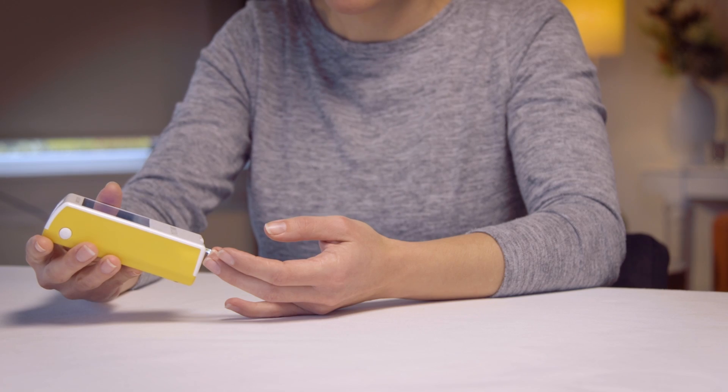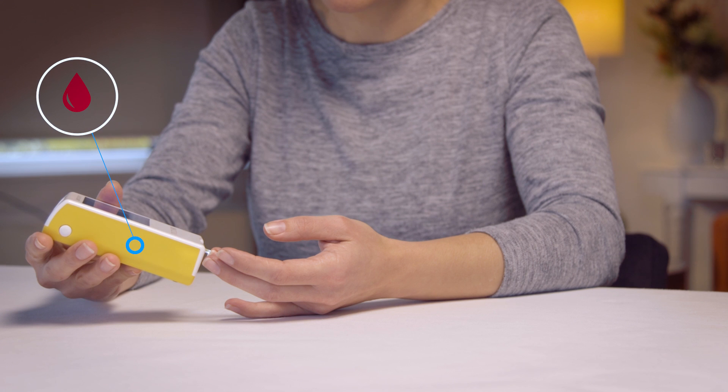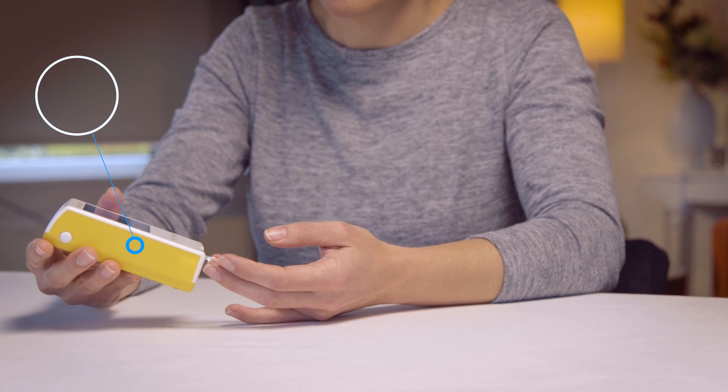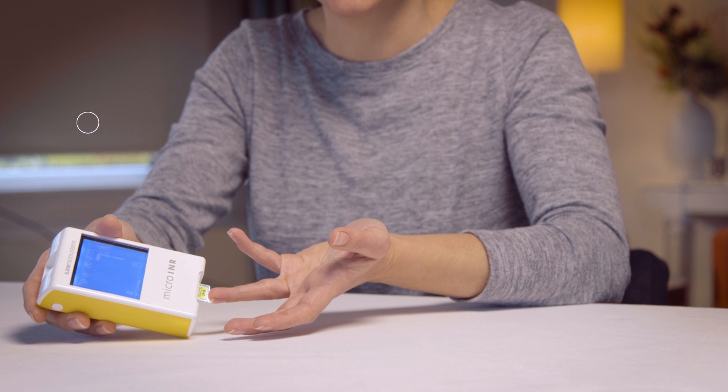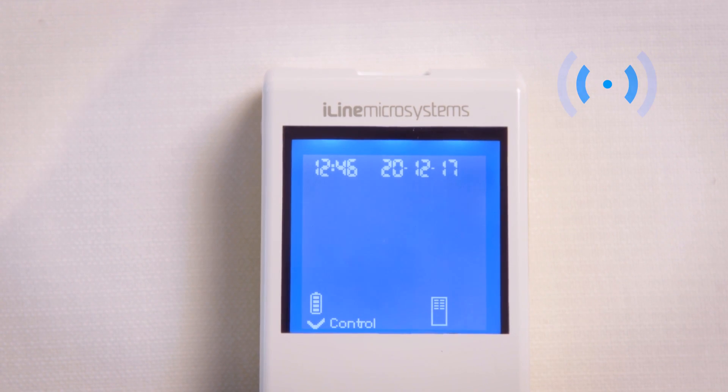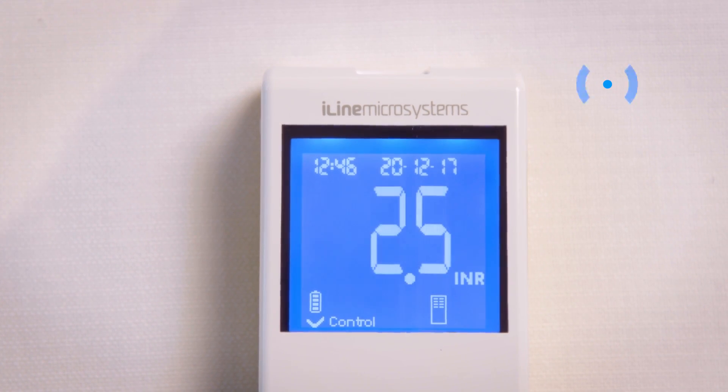Only the drop of blood must make contact with the chip. When the meter detects enough blood sample, it emits a beep tone and the drop symbol stops flashing. After the beep, gently remove the finger, leaving a small amount of blood at the entry channel.